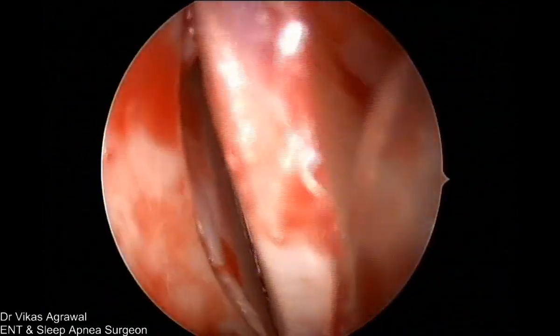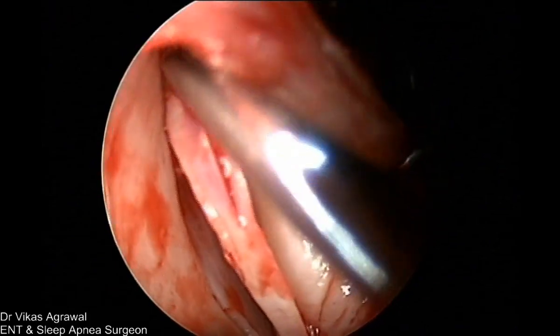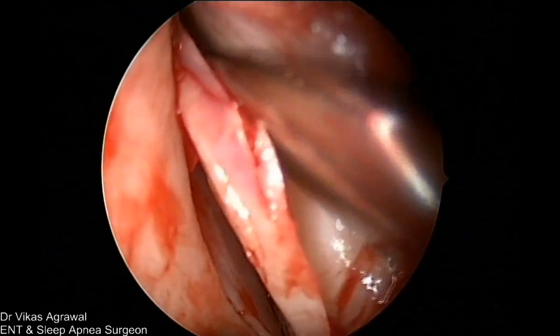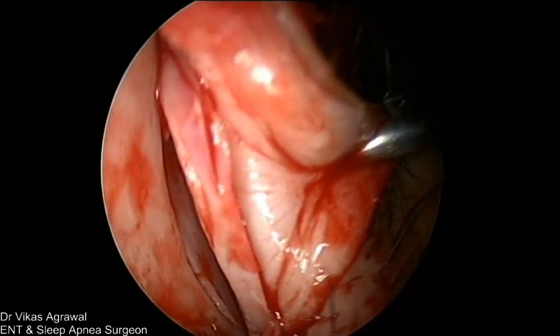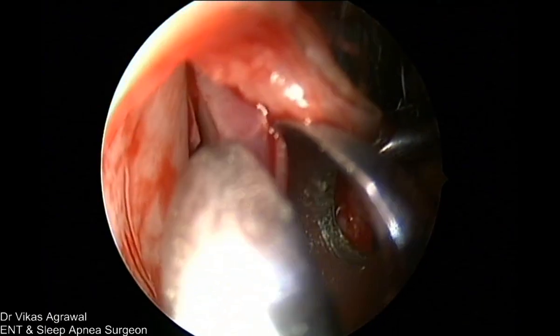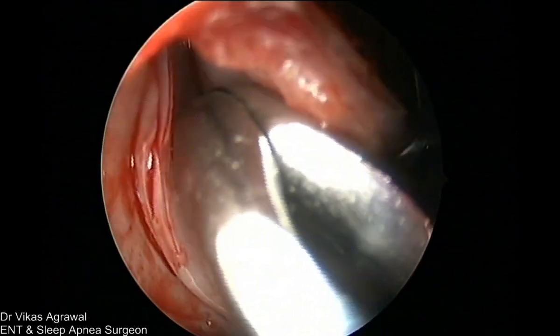Now, as we saw, if you go very high and remove the part of the cartilage which is below this nasal bone, then there will be no problem. But if you come ahead, there will be a problem. And you see this cartilage, how is the tilt? This cartilage is like this, so if I go behind and remove, it will not work; it will still remain.